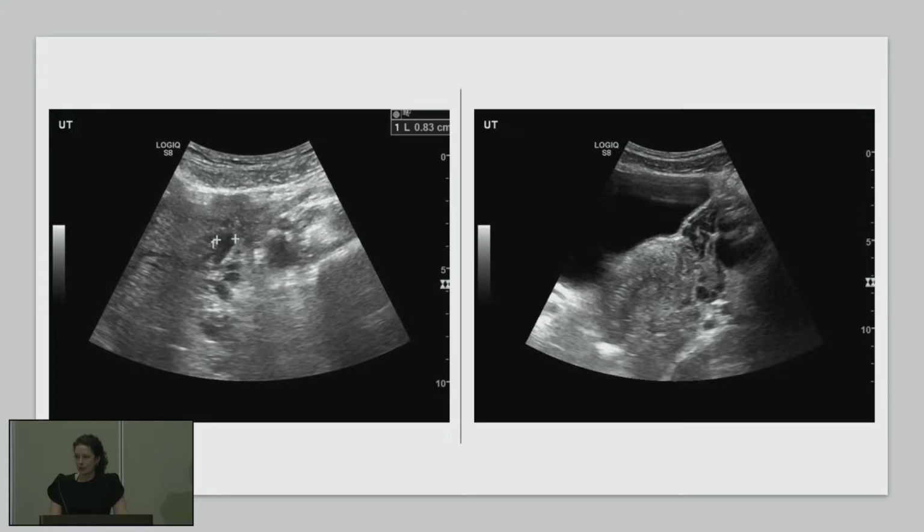When looking at periuterine varicosities, veins are normally seen on the uterus and ovaries. That does not mean they're varicose. We're looking for veins that are 6 millimeters or greater and multiple, not just one, not just two, but a lot. Like you're thinking varicose veins, but around the uterus and ovaries. So have the patient, if possible, come in with a full bladder because it provides a really nice window of the uterus and it kind of tilts it back. So you're able to see those veins without so much bowel obstruction.